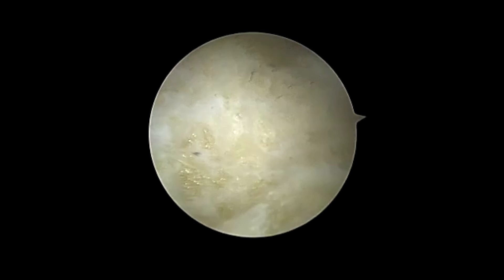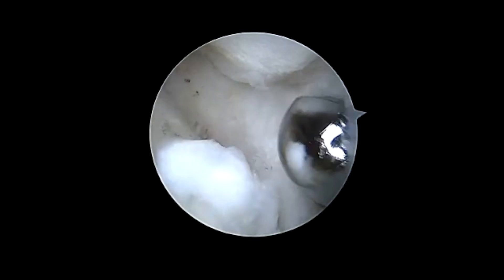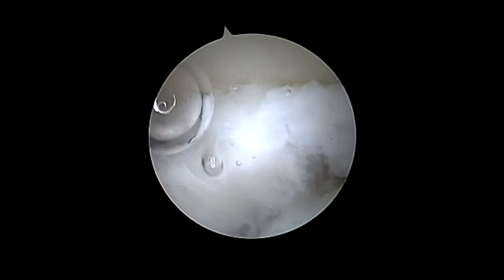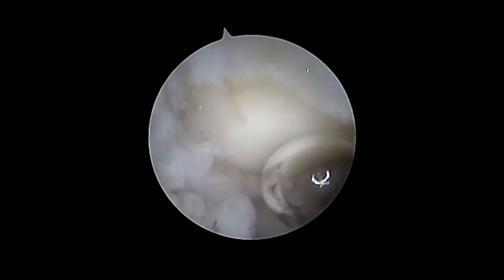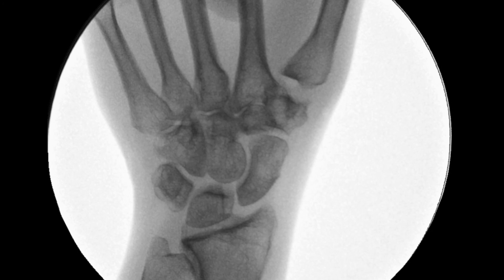Arthroscopic joint debridement and loose body removal is an excellent tool for the treatment of early to moderate stage CMC joint arthritis of the thumb in young patients who do not wish to proceed with arthroplasty procedures. There is minimal downtime after surgery and most patients return to activities of daily living on an unrestricted basis two weeks after surgery. Final C-arm images demonstrate hemi trapeziectomy with removal of the loose body previously visualized on the preoperative films.